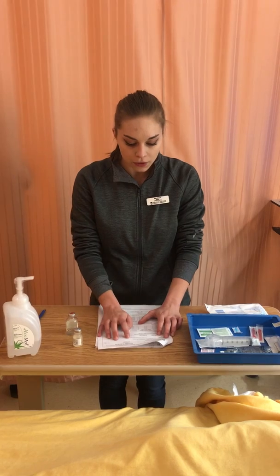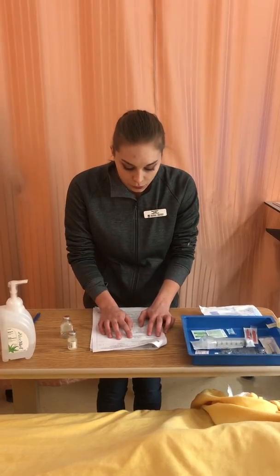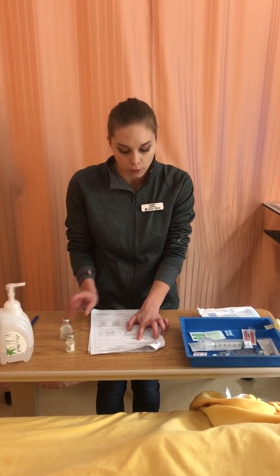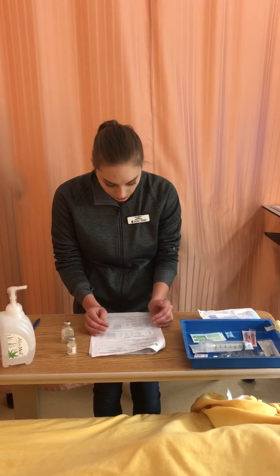So, first thing I want to do is make sure that I'm able to give this as a student nurse, which I am. I'm also going to check the usual dosage, which is a range of 1 to 4 million units every 4 to 6 hours. I'm giving 3, so I'm within this range, and the maximum single dose is 5 million units. I'm giving 3, so again, I'm able to give it.